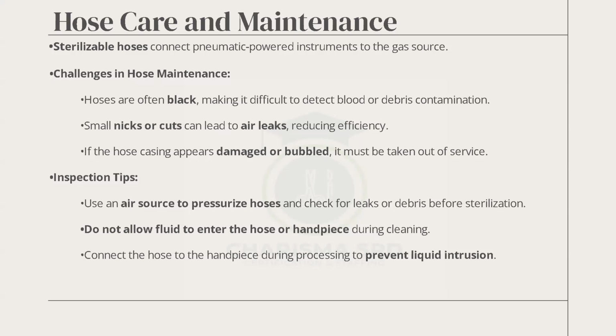Because if water goes in and you connect it, what happens? When the instrument is being used, the water that was sitting in the hose is the first thing to come out. So you contaminate or you infect somebody with it. So we always ensure that water does not go into the hose.